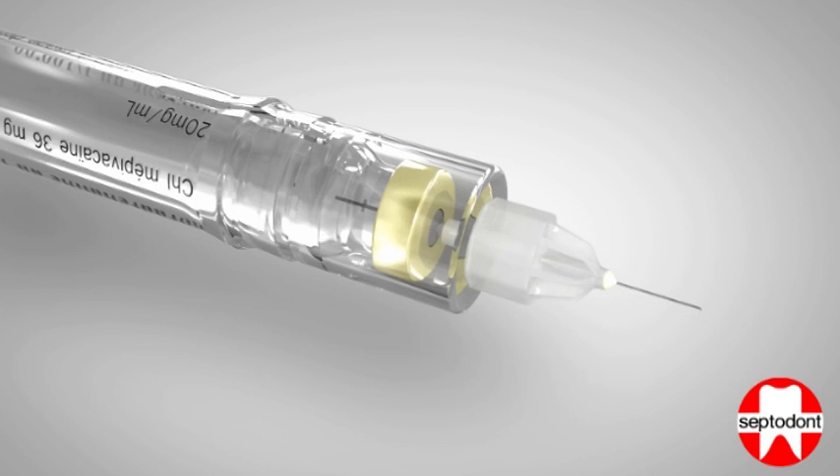At the rear end of the needle cannula inside the cartridge barrel, there is a small protuberance. Throughout the injection procedure, this protuberance depresses the cartridge diaphragm, resulting in aspiration when injection pressure is released.